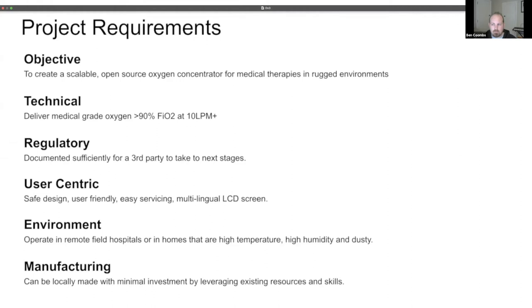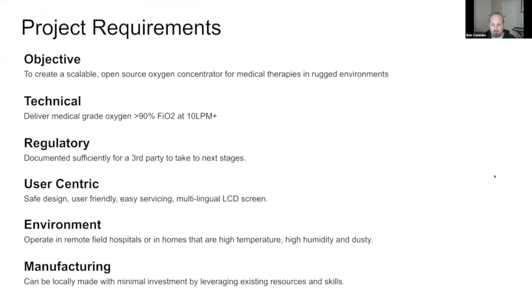It's anticipated that OX will be used at home by patients themselves, so there is a strong need to focus on user friendliness and safety. OX is designed to be used in challenging environments where it may be hot, humid and dusty, which shortens the lifespan of typical consumer oxygen concentrators. The key requirement is that OX is easy to manufacture virtually anywhere in the middle of the pandemic. All the materials and components have been carefully selected to be easy to find in common sizes through alternative supply chains, and OX can be made by hand with simple tools.